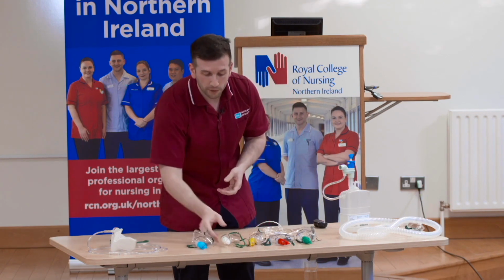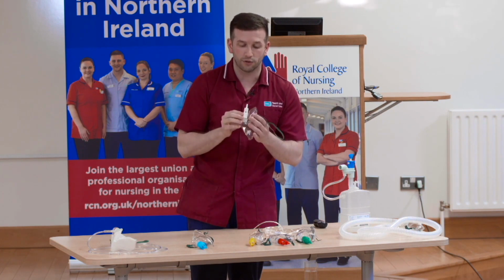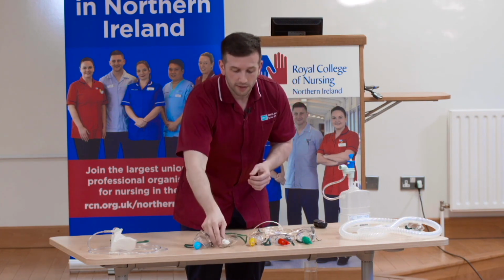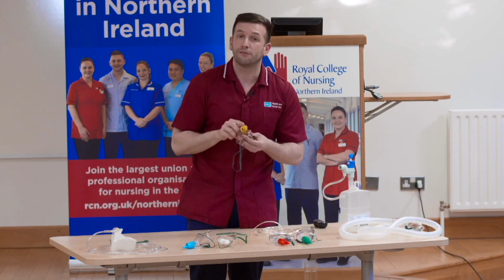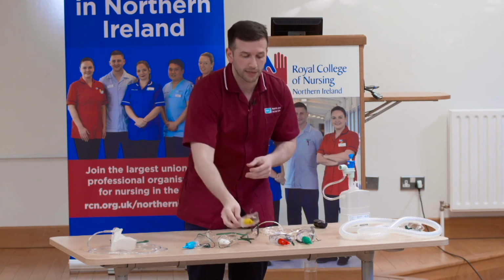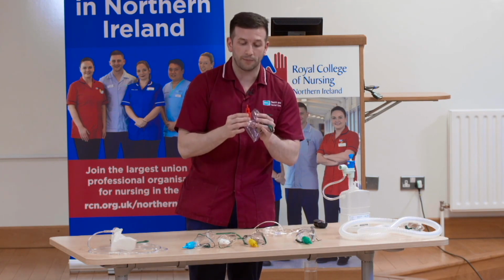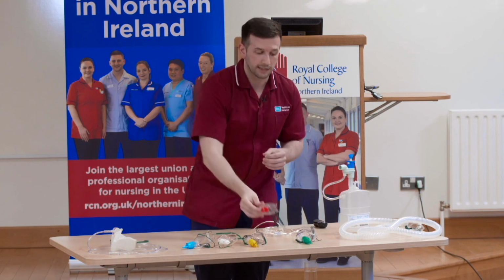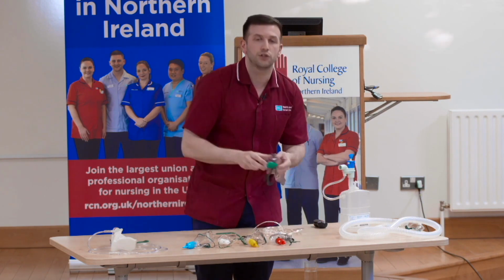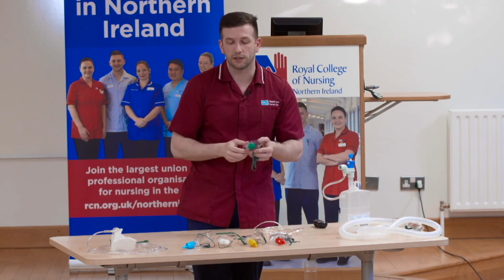As we move up, we've got the 28% oxygen therapy, and it's run through at 4 litres per minute. The next step up would be 35% oxygen, and it runs through here at 8 litres per minute. The next one up would be the 40% red Venturi barrel, and it runs between 8 and 10 litres per minute. And last, you've got the 60% Venturi barrel, and it runs at 15 litres per minute.